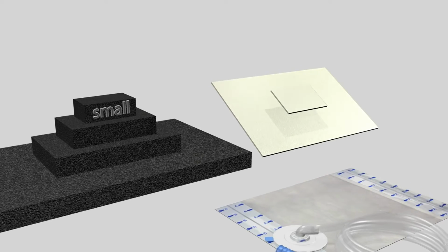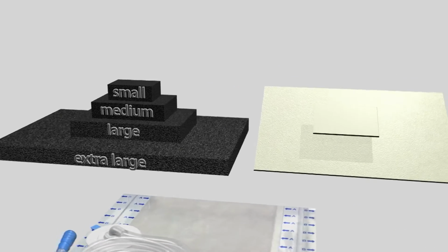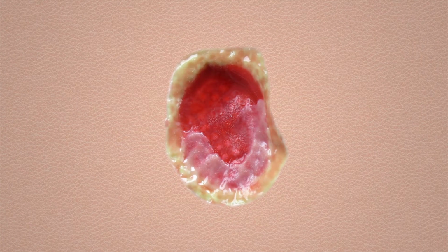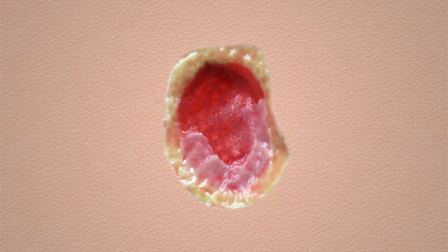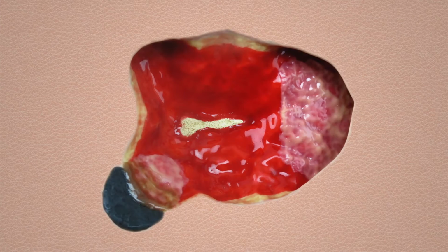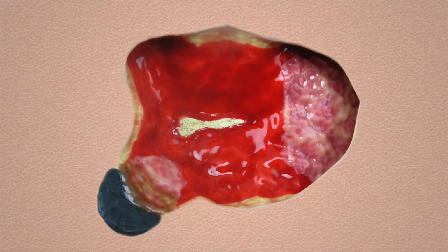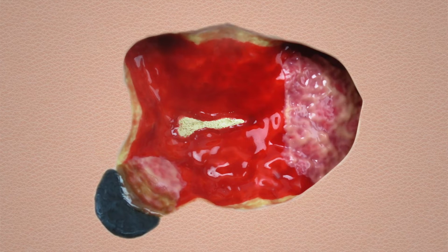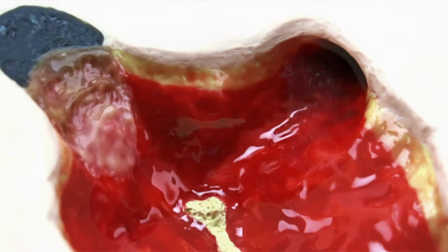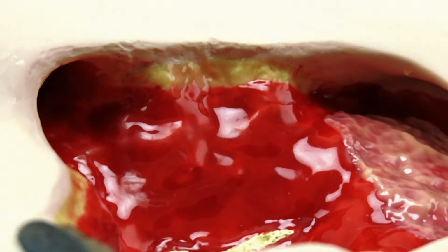Cardinal Health has small, medium, large, and extra-large black foam dressing kits, as well as white foam dressing kits in 2 sizes. If the wound bed is 100% clean or granular, the black foam dressing set is indicated. If the wound bed is fragile, or if there is bone, tendon, or hardware visible, white foam is indicated to protect the structures. White foam is designed to be a protective, non-adherent interface. If there are tunnels or undermined areas, they will need to be filled.